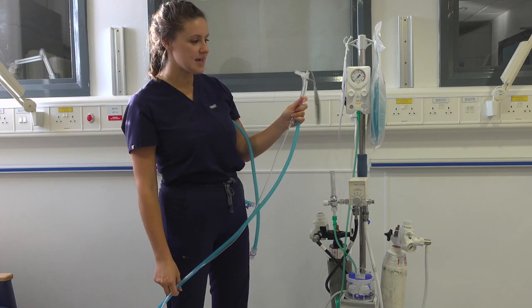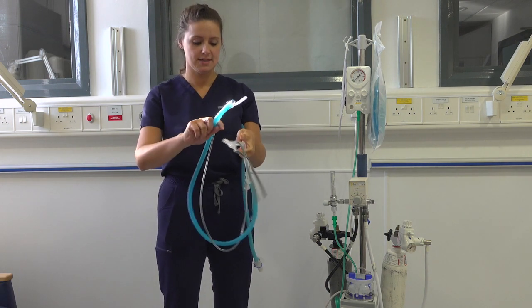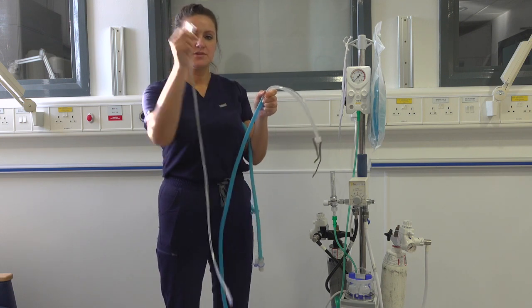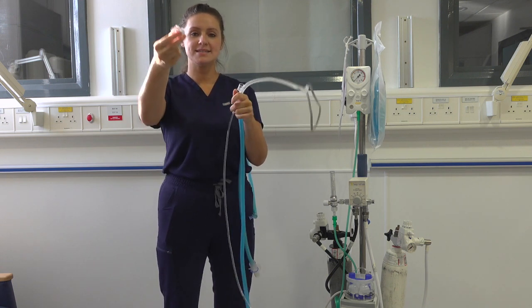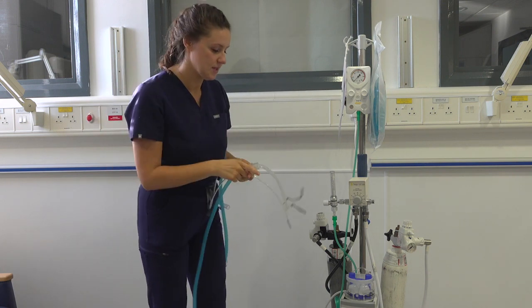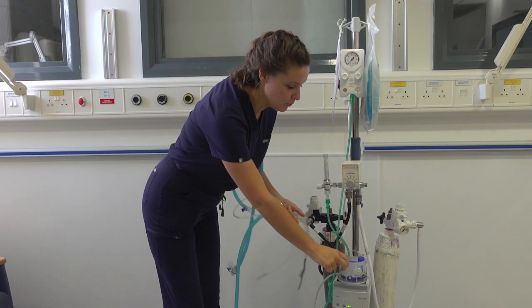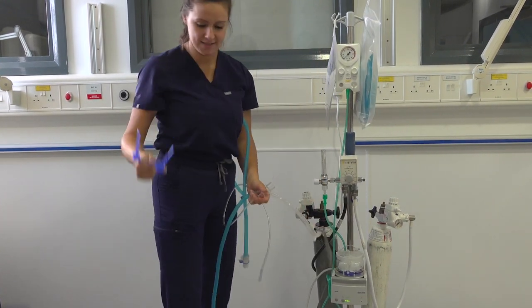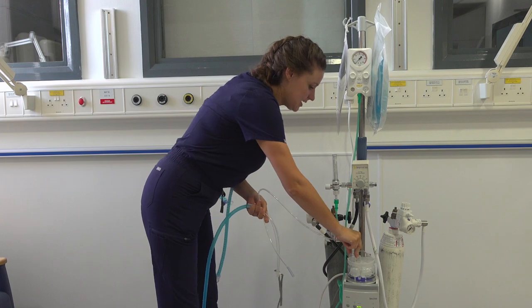So now if we think about setting up the machine, this end will be at your baby's face. To connect the humidification circuit we need to remove this clear tubing attachment and connect the clear adapter on the end. This clear adapter will hook into your humidification dome. If we pull off the protective casing like so, we can then attach this clear end into the dome.